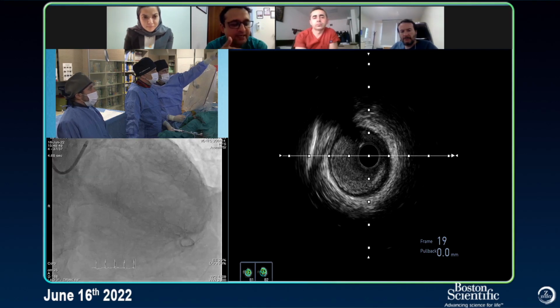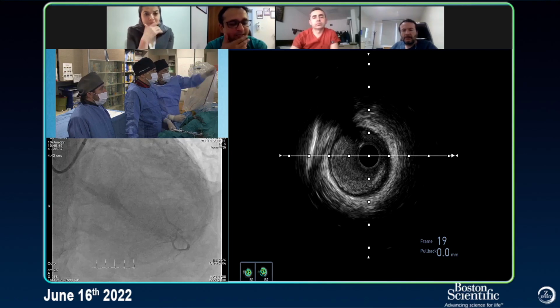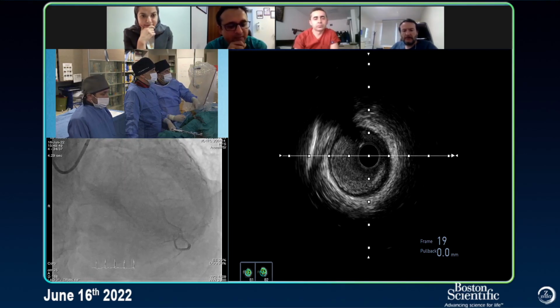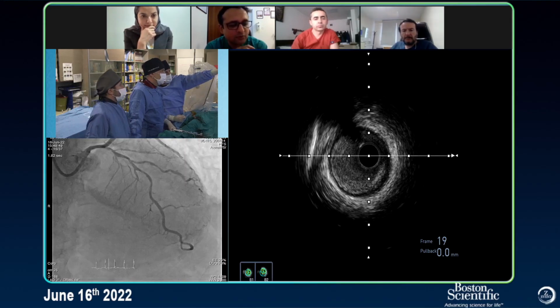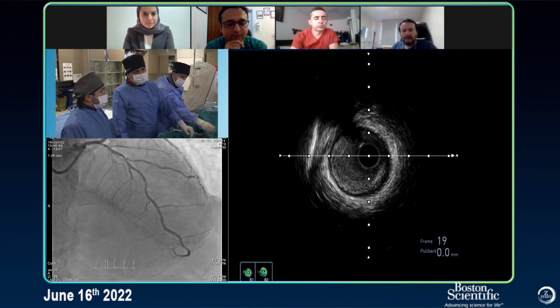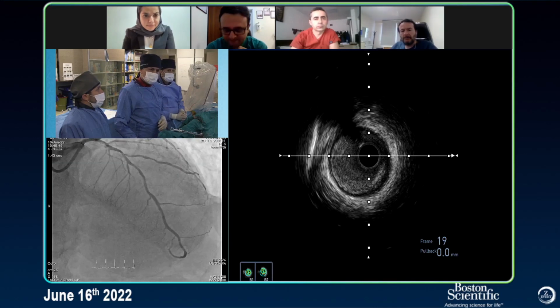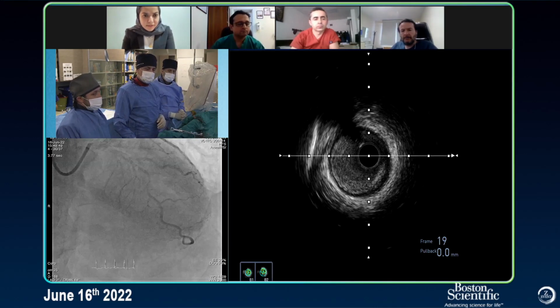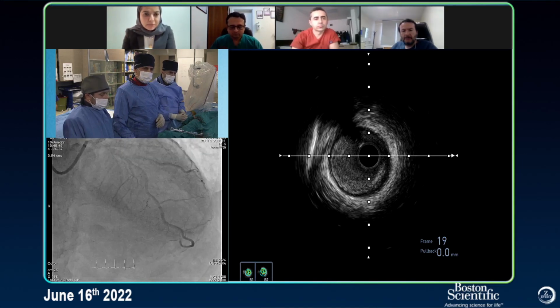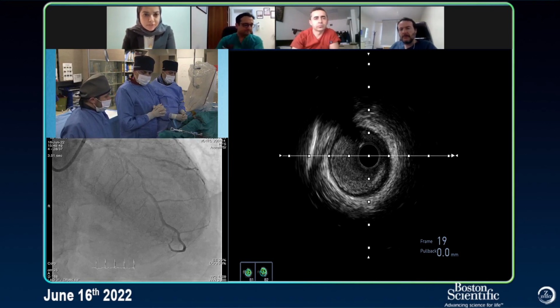We really need a two-stent strategy in the diagonal LAD. It's a long lesion. So if we can avoid coming into the left main and making it a double bifurcation case, that would be great. So definitely agree with Shakir. Look at the ostium of the LAD and see what the MLA is. If the MLA is more than 4, I won't come into the left main. All right. And I can see with this eccentric calcification, atherectomy is definitely a great approach here, as opposed to other modalities, NC balloons and IVL.